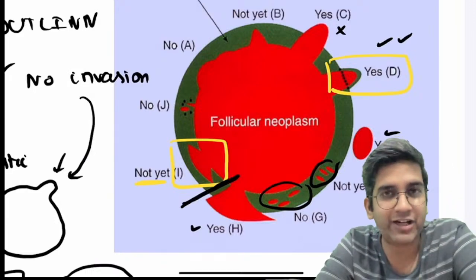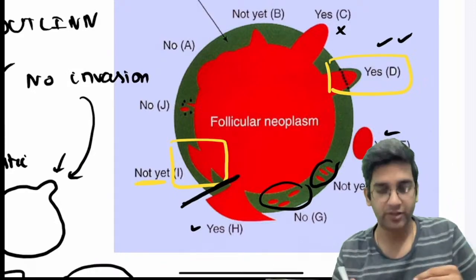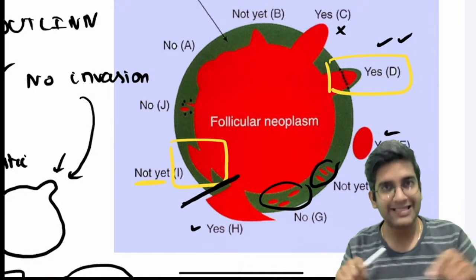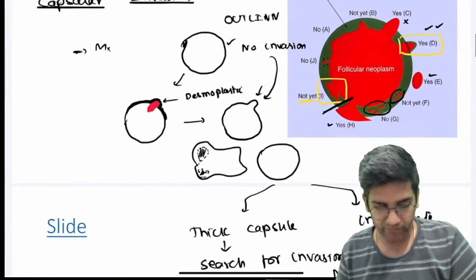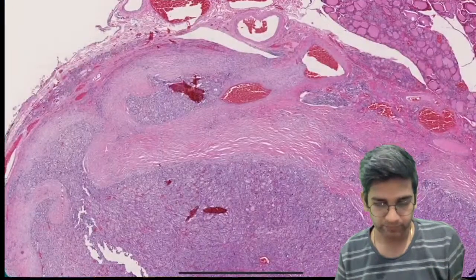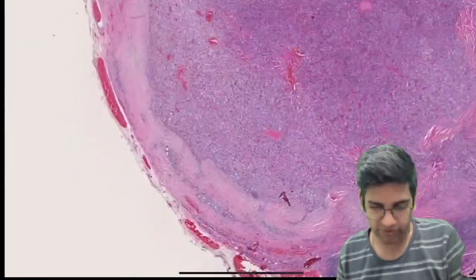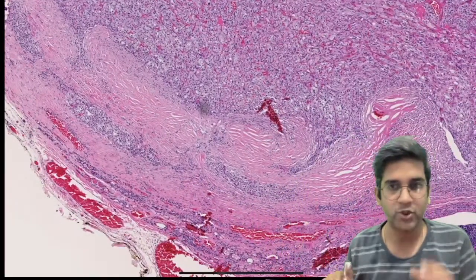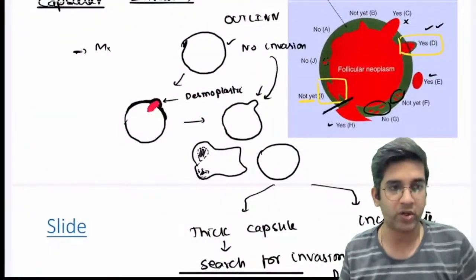Previously also I didn't have a clear statement of what if it's not extending outside the outline but it's still inside, like what we saw in this slide, right? Like what we saw here, it's not going outside completely but looks like it, right? So what do we qualify, what do we quantify there, right?